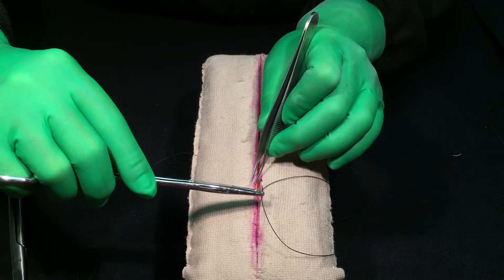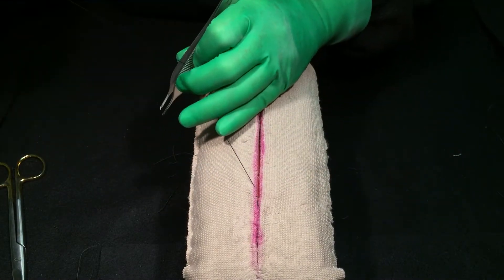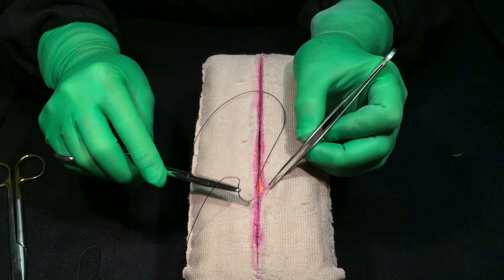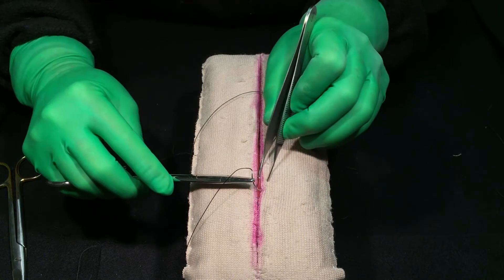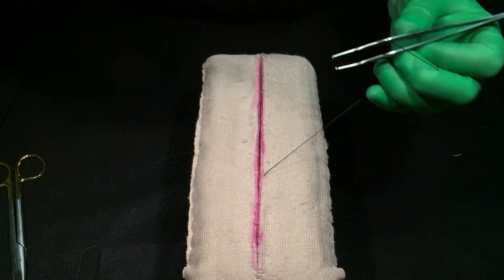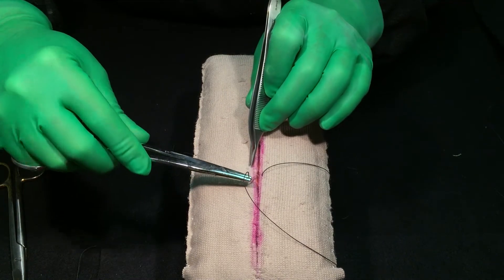The box stitch, which OBGYNs use on pfannenstiel incisions where there's really no tension on the incision when the patient stands up, goes around subcuticular. Here's where my last stitch was — instead of going back to that, the box stitch goes directly across from it. Again, directly across. It will approximate it, but it's not quite as strong as what I call the Z stitch.